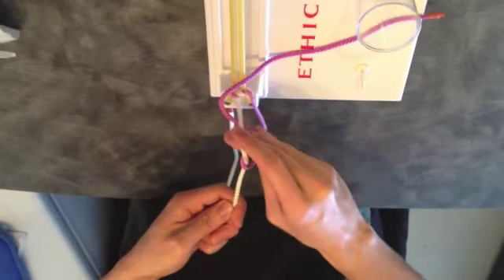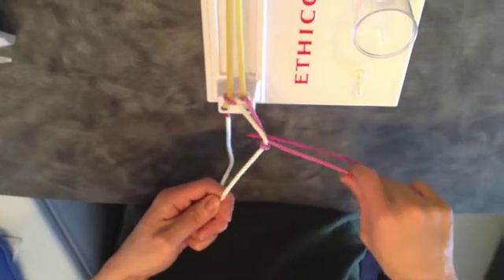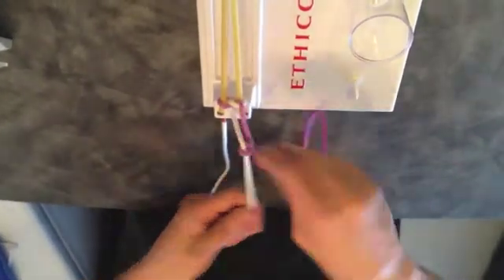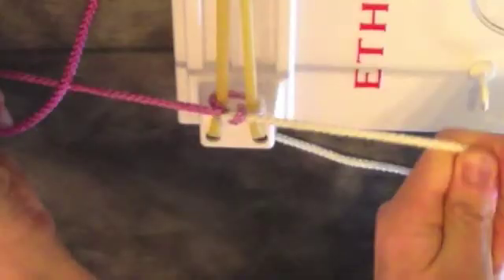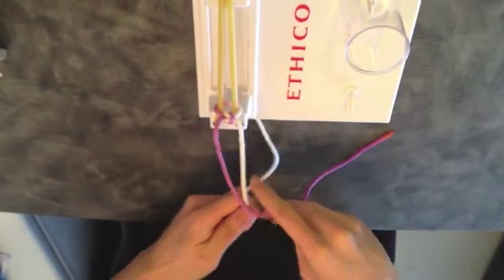Use your right middle finger to push the strand through the loop. Cross your right hand over your left hand to secure the second throw. Repeat the process until you have a secure square knot.